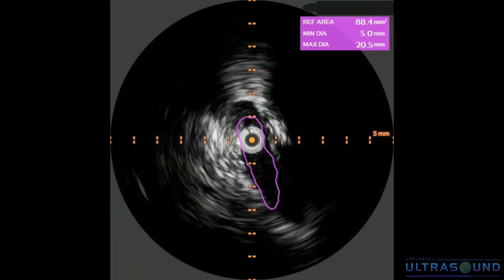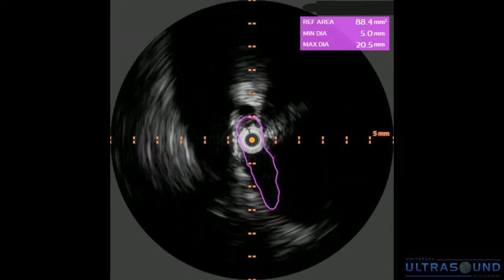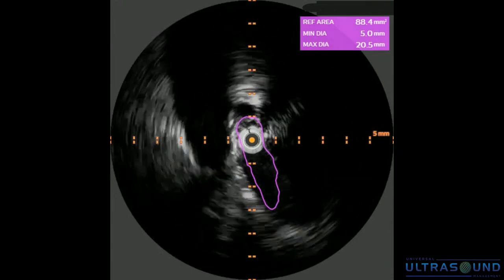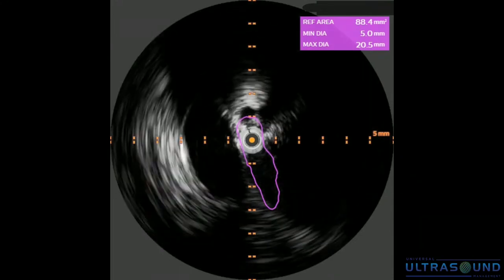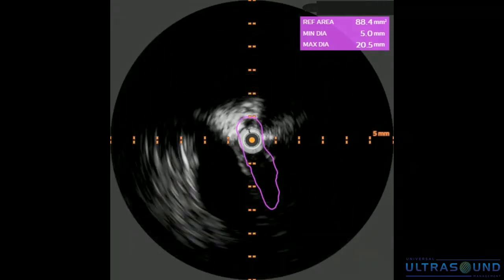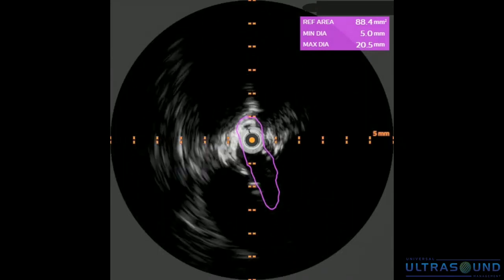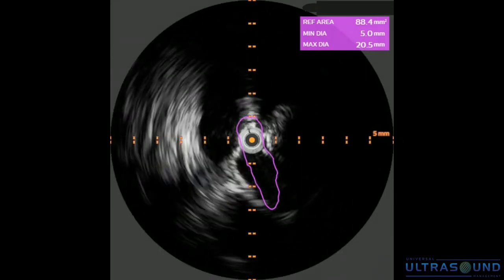And what they do is they measure the external iliac vein and figure out what the diameter reduction is in order to figure out the percentage of the stenosis. So here we are, we're pulling up towards the confluence now. You can see the artery pounding on the vein wall on the left, and then he's leaving the IVUS catheter there for a minute, and then he's going to come through to the inferior vena cava.